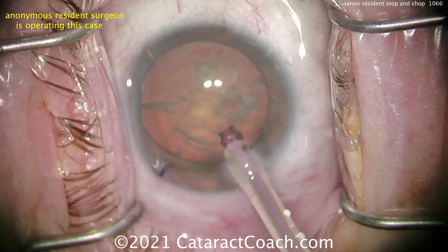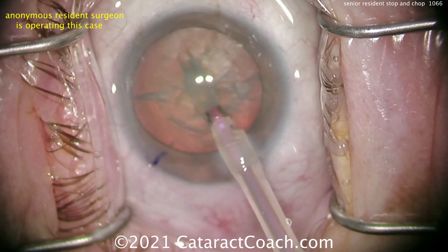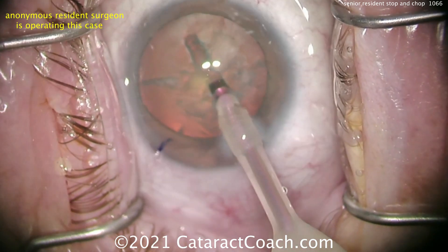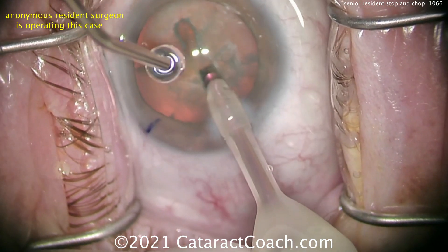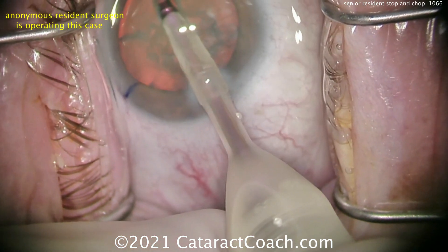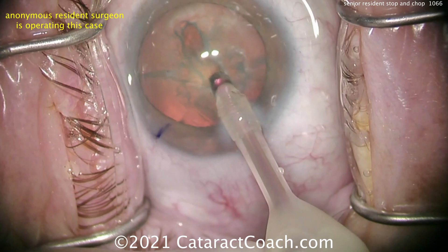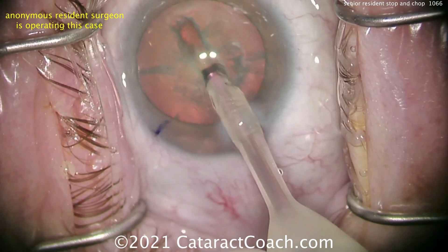Bevel up. Cleaning up that epinuclear material, then a groove down the middle — so maybe a divide and conquer or a stop and chop. Notice how the eye stays in primary position. I like it — this is very good. The novice mistake would be to push the eye towards the nasal canthus. But the eye is staying in primary, so those light reflexes are in the center of the cornea. A nice groove going on there. That looks great.